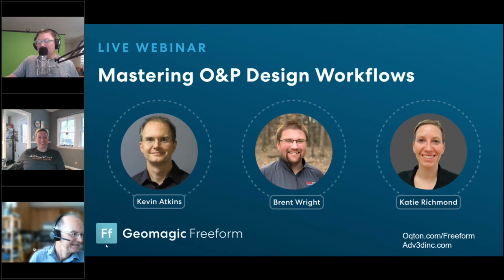There are some super cool tools in the molding stuff, but I don't know anything about that, so you'd have to get up with Kevin. Yeah, there are some molding tools in Freeform, and if you do have questions there on how to use those tools, again, we can take it offline and figure that out later. It's a way bigger conversation than this Q&A session.